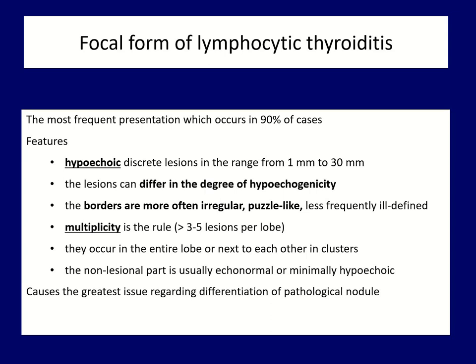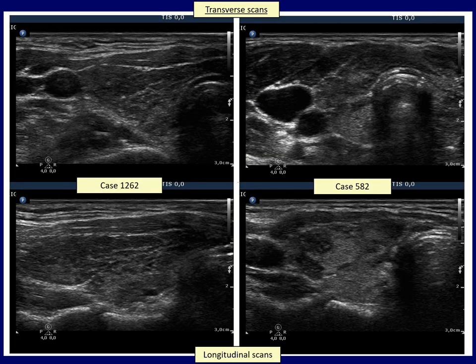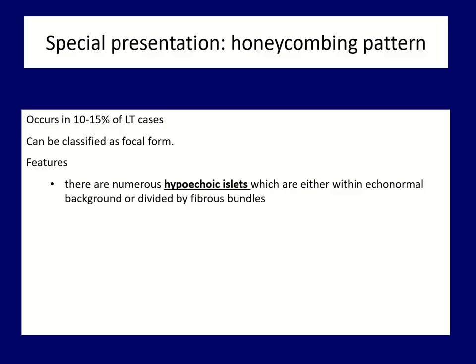I give only two examples here. The left case should not cause concern — the thyroid is hypoechoic and has more hypoechoic discrete areas. This is the typical presentation of lymphocytic thyroiditis. However, if we were to stick to the American Thyroid Association definition of thyroid nodule, we would have to call these discrete lesions nodules. The case on the right is much more problematic. Nevertheless, the shape of the discrete lesions and their multiplicity clearly suggest these are more active foci of thyroiditis than true nodules.